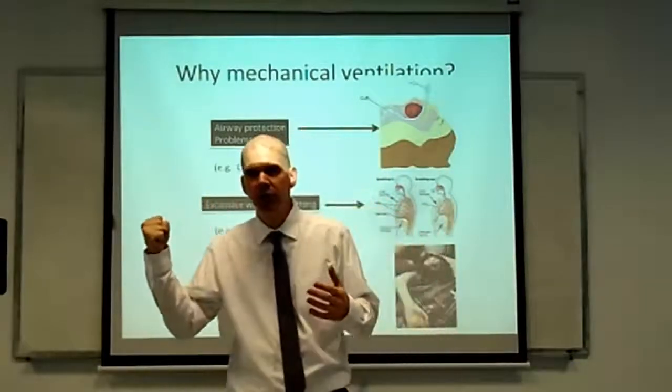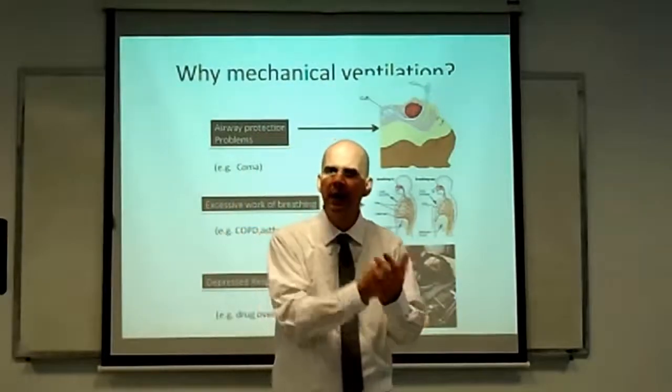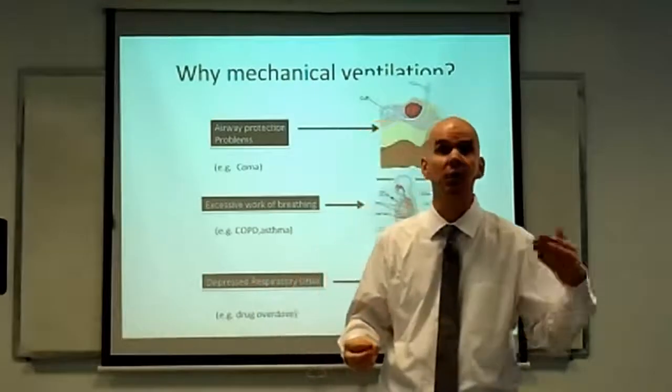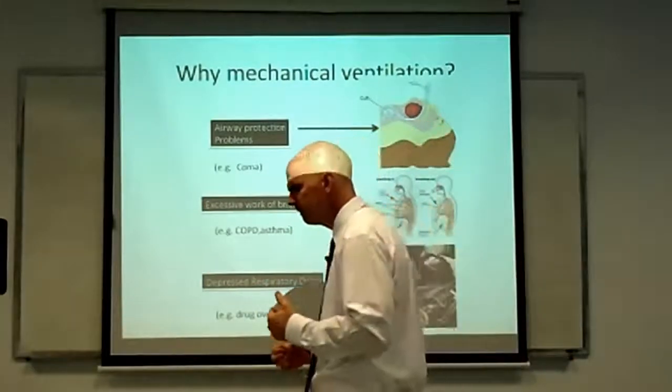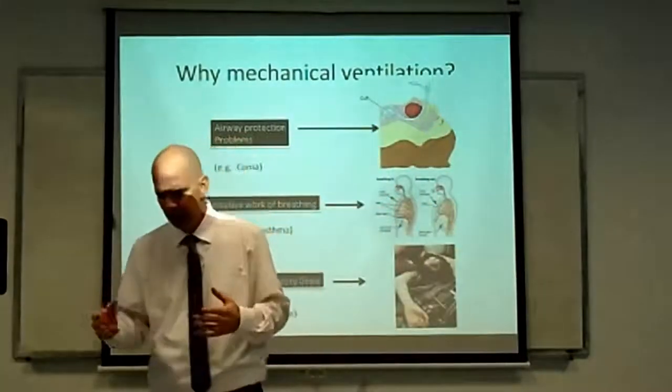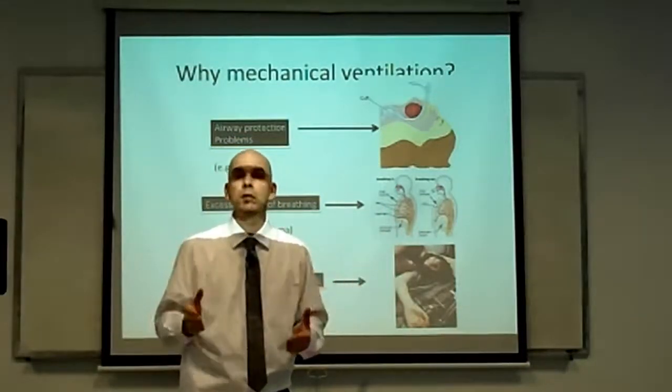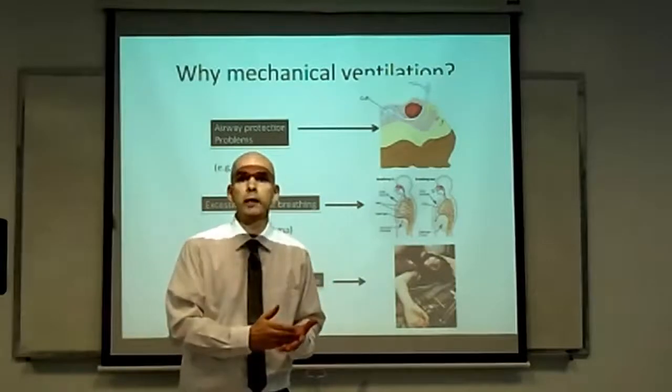Here we use positive pressure ventilation to pound in that air at the rate requisite to maintain life, where the patient isn't otherwise inclined to himself. Okay, good. So we've got these indications down. Let's say we have a patient that meets one of these indications and we want to ventilate him.